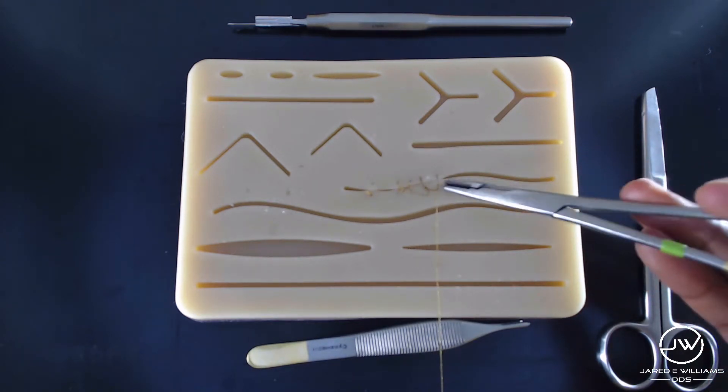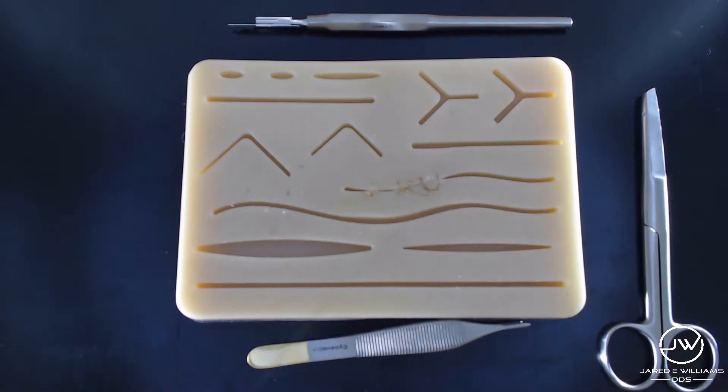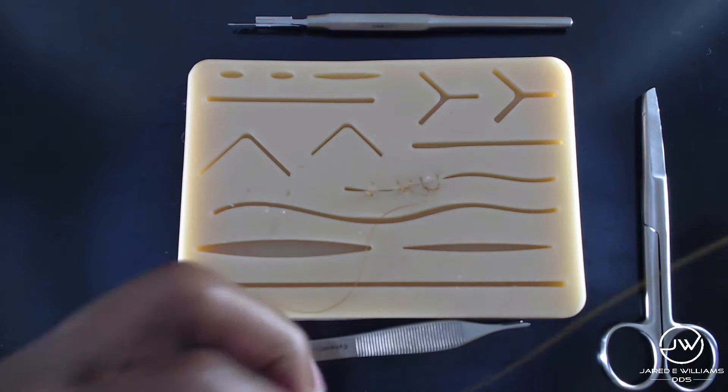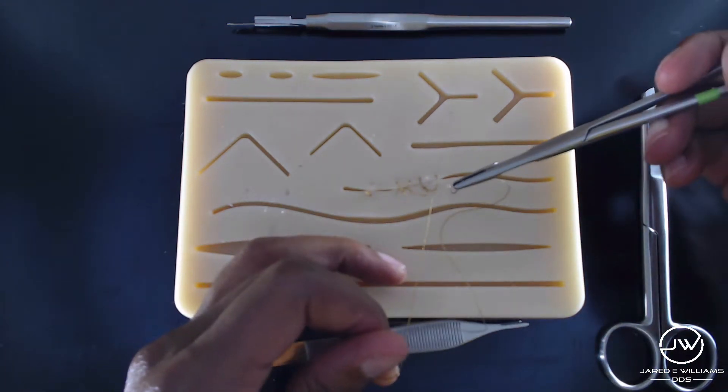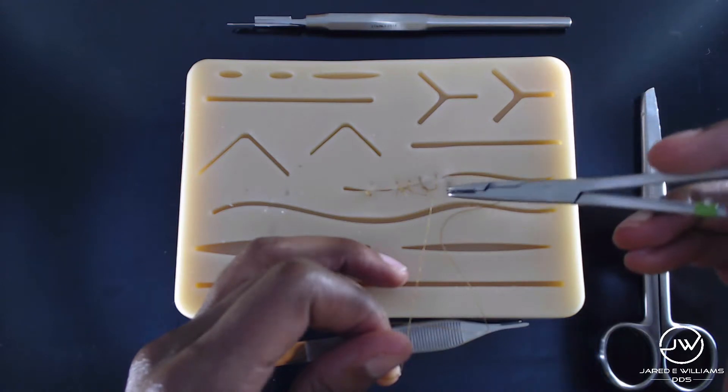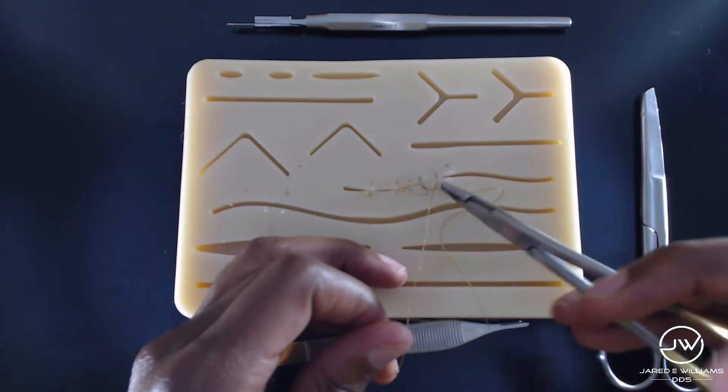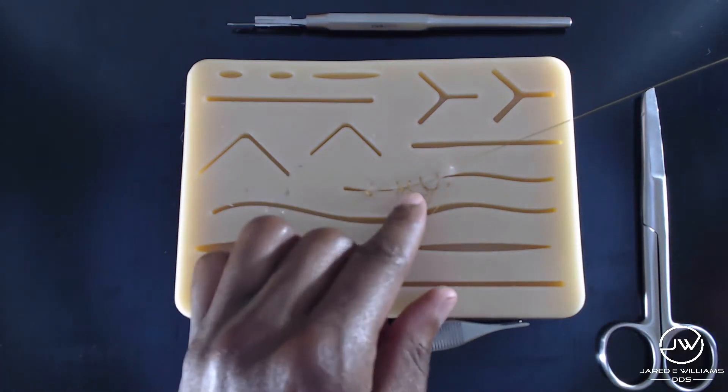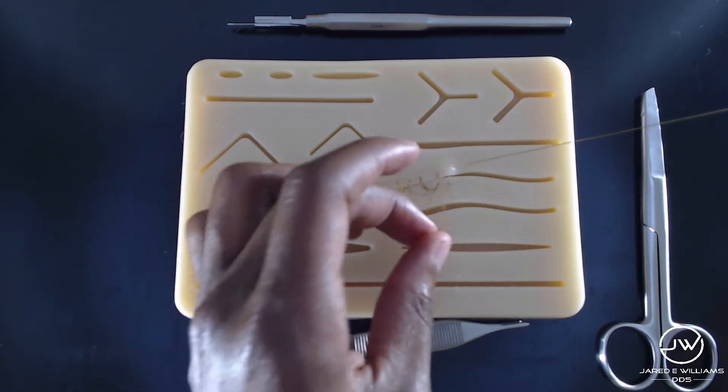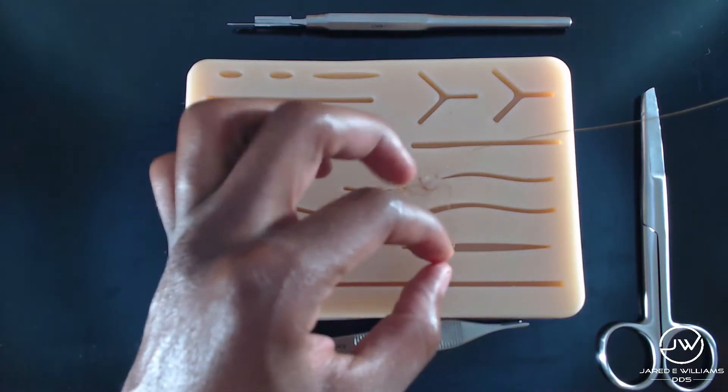The reason why I didn't work there is because my knot was too long. I'm going to pass it through again. So, we're on the same page. And this is the continuous locking suture. The issue that I had with this one is that this tail was way too long. So, make sure your tail isn't.